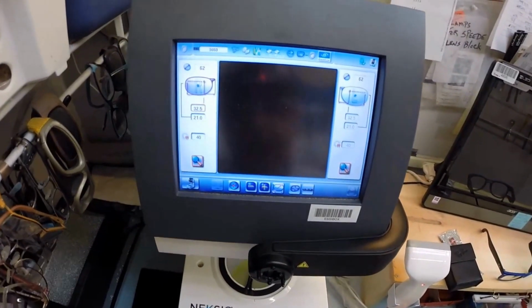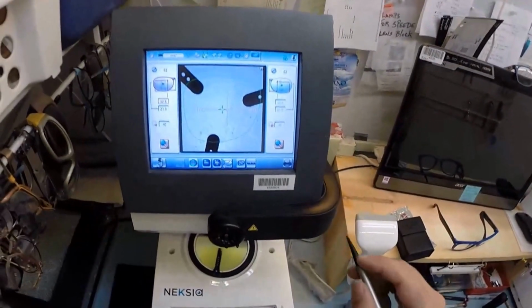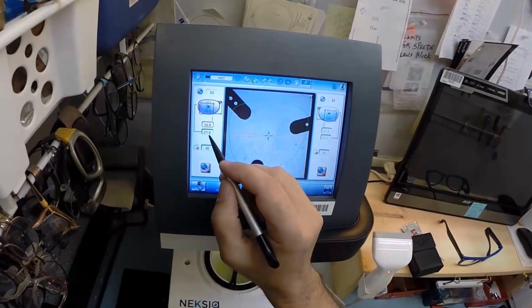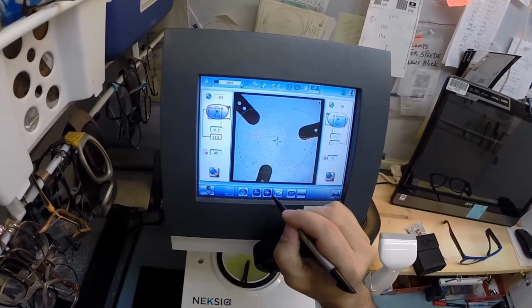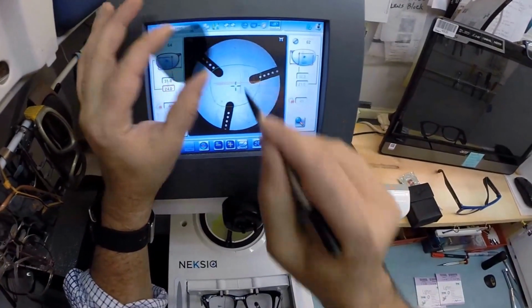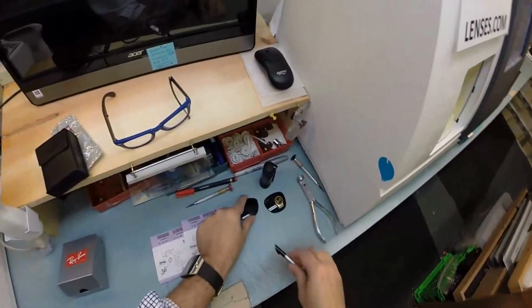Ramiro needs a little bit of magnification when he's doing all that studying, getting ready for med school. So I'm going to put in some lenses that will help alleviate any eye fatigue that he is getting. So I do want to adjust one thing here. I'm going to raise up the optical centers as well. Now this is the shape of the lens I'll be cutting. Let me grab one of them. I will minify it down to its normal size, and that green outline is the shape I will be cutting today. I will go ahead and magnify it while I'm working on it.